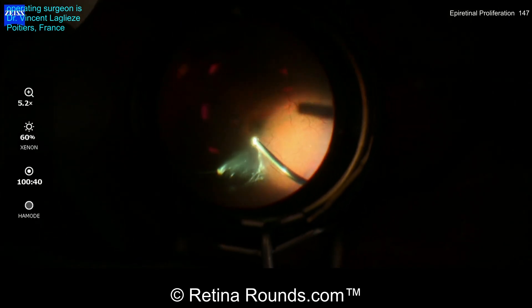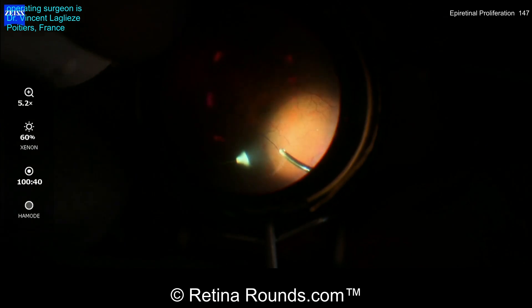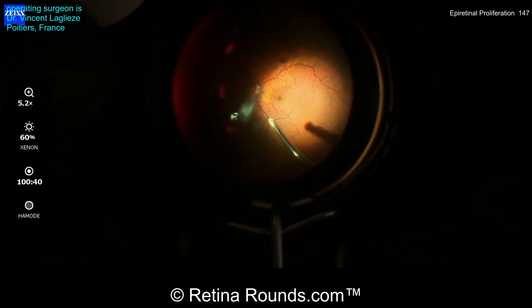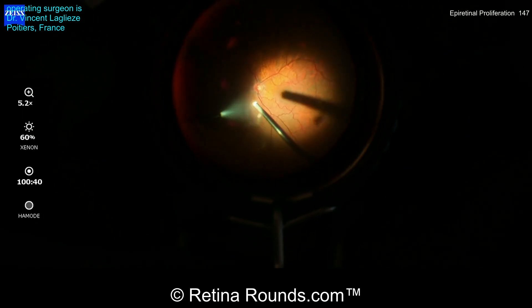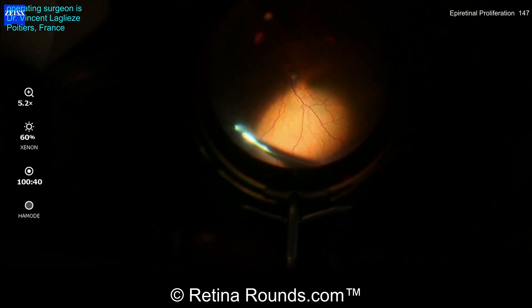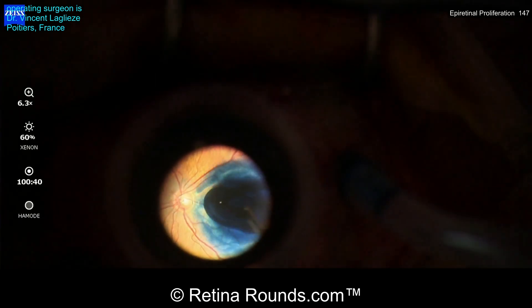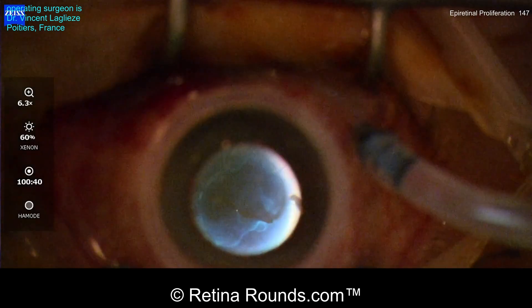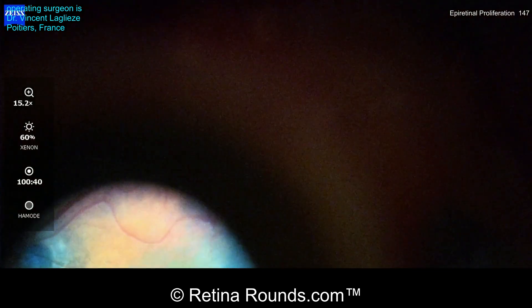The three trocars are in place, and now Dr. Leglaise is going to start by performing a core vitrectomy. We saw in the OCT that there appeared to be a posterior vitreous detachment, and you can see here that he is removing the vitreous over the optic nerve and extending the shaving 360 degrees. Once the vitrectomy is completed, the vitreous cutter is being used to reflux tissue blue over the posterior pole to stain the ILM.